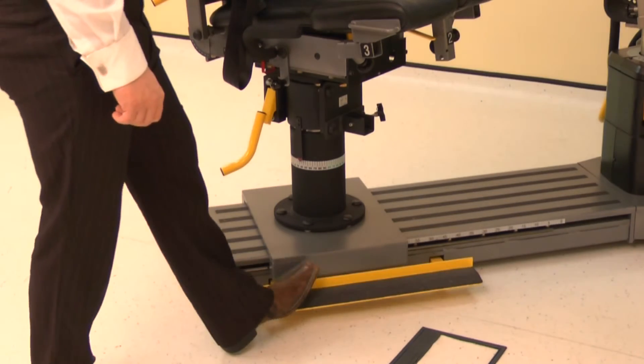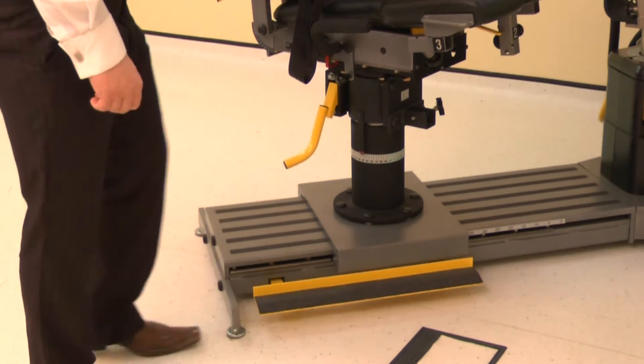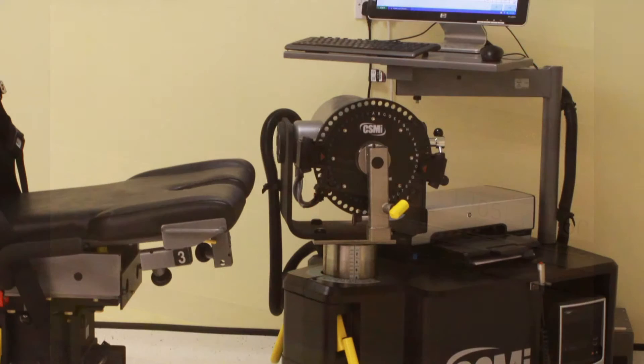Finally, position the monorail by pressing the kickboard and sliding the chair to position 75. The dynamometer is normally positioned so the subject stands on the base plate. However, it can be rotated for taller subjects so they stand on the floor.